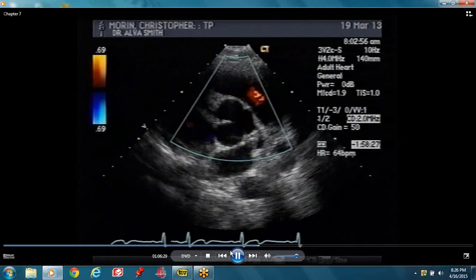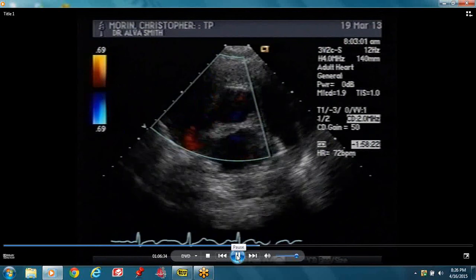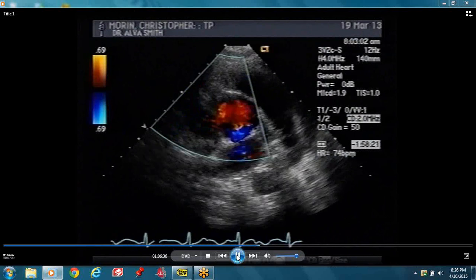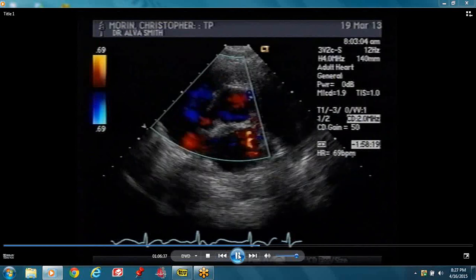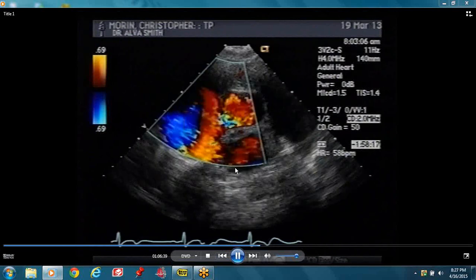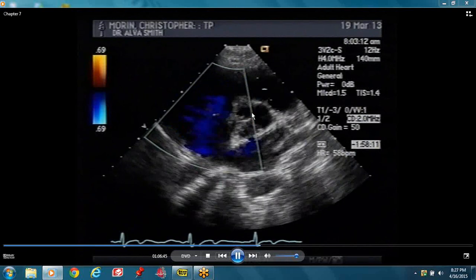Look at the aorta — you can see that there are three leaflets or three cusps. Another important pointer: your interatrial septum abuts the non-coronary cusp. This is your interatrial septum, this is the non-coronary cusp, and then this is going to be the right and this will be the left. So one, two, three — this is the non-coronary, this is the right, and that's the left.